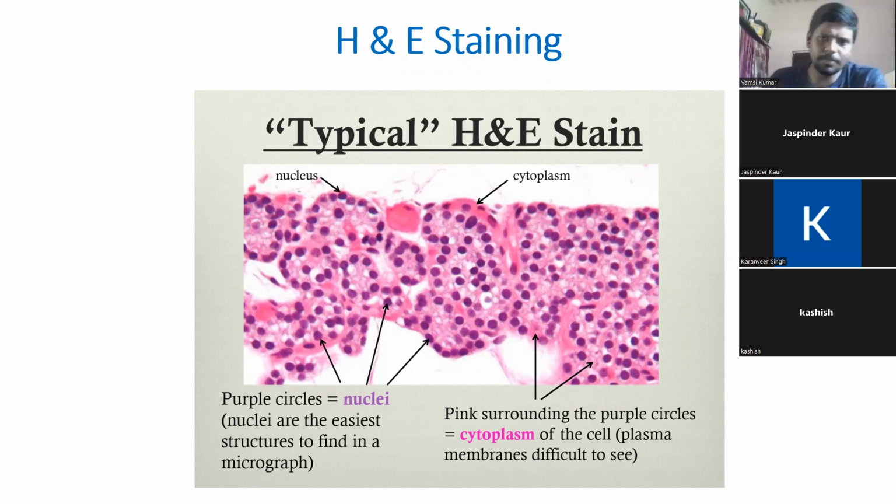In the tissue that you are seeing right now, this patient has normal tissue. His thyroid tissue looks perfectly fine, but he has a serious cancer in his body. That cancer is right in front of us, hiding in front of us.